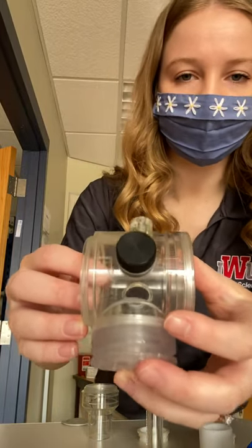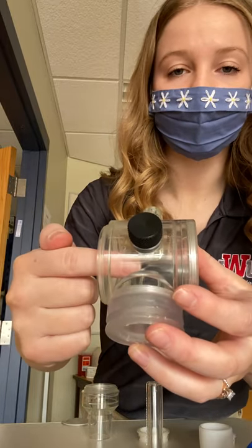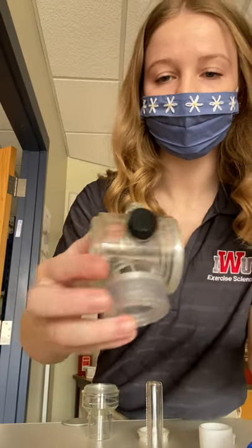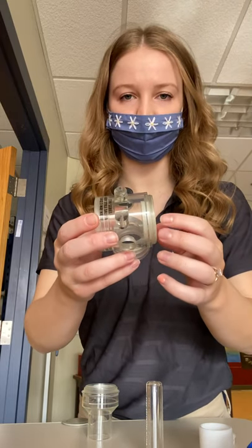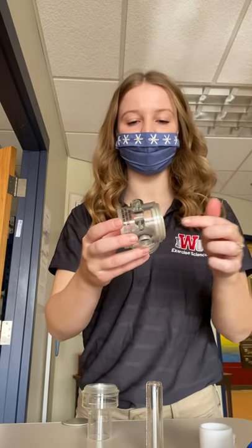All right, so now you need to look at the arrows on the center valve. There's one side where the air is coming in and one side where the air is leaving. The side where the air is coming in — that's going to be where your inspiratory valve goes. You want the one-way valve oriented so it's able to let the air pass through.